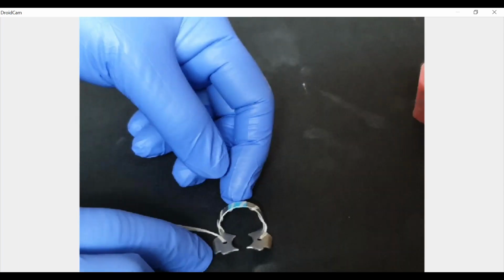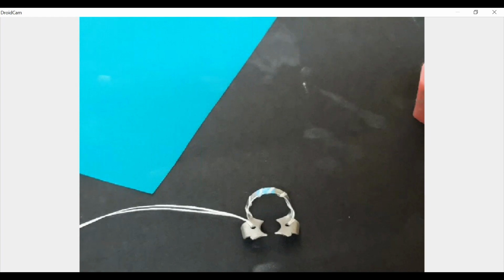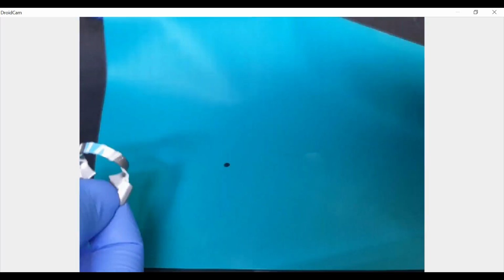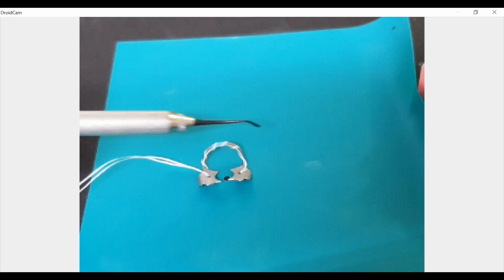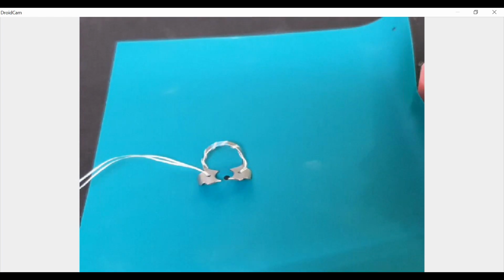Now once we have secured the clamp, we will perform the isolation. Now, after you have a certain level of experience, you will directly mount the clamp forceps and then engage it on the rubber dam. But beginners, kindly don't do that. Beginners will stick to basic things. Here we have it. And remember, at the end of placement of the clamp inside, my jaw should be parallel to the upper edge of my rubber dam sheet. Otherwise, you will not get a centralized isolation. The rubber dam will either tilt or it will shift to one side.